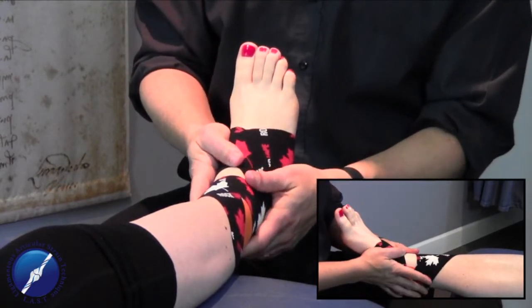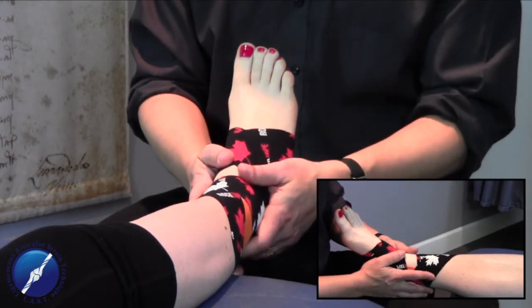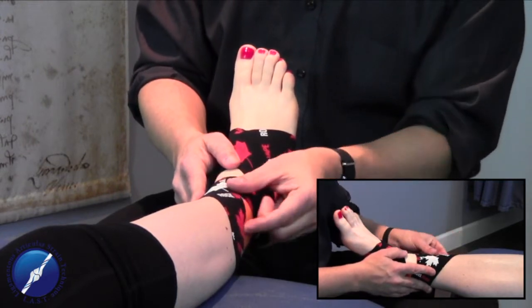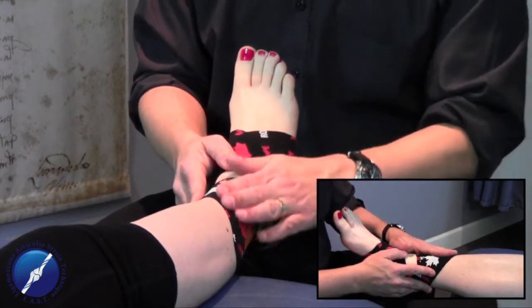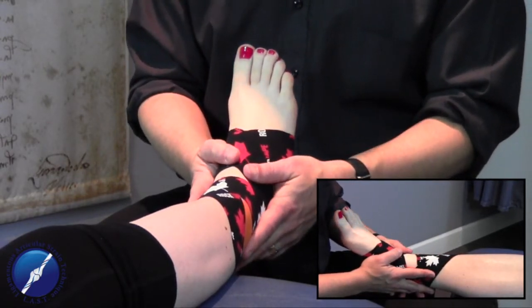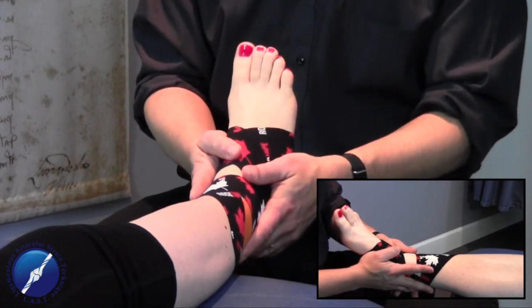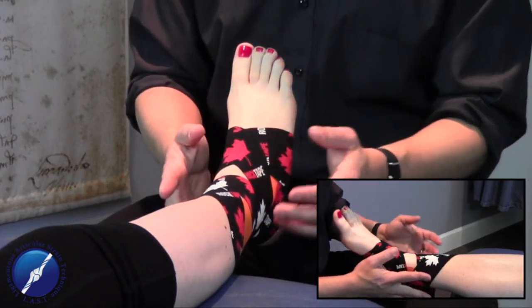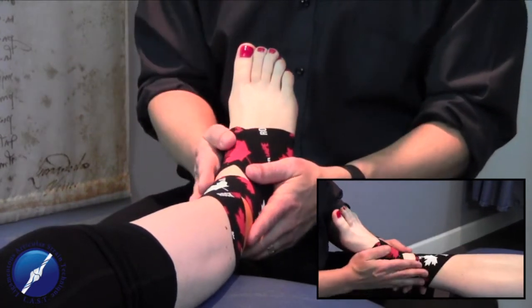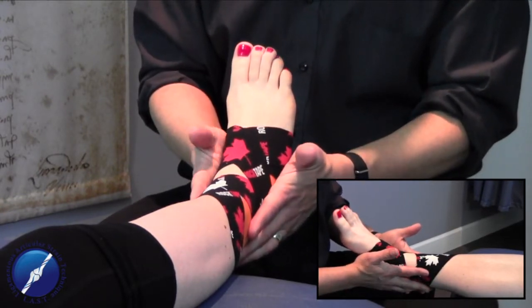The tape can stay on for three to five days. They can be active with it, get it wet, and sweat with it. If the tape starts to peel off, they can trim the edge and re-tack it back down. After about three to five days, the neurological messaging or neuromodulation has been maximized and it's time for it to start functioning on its own. We don't leave the tape on for a long period or do multiple applications back to back, because the body adapts and it becomes ineffective.